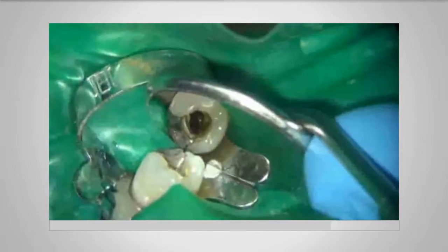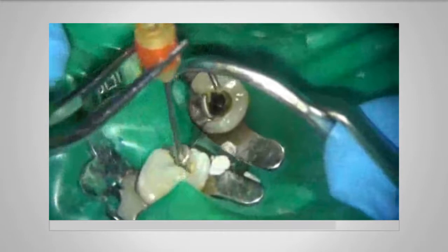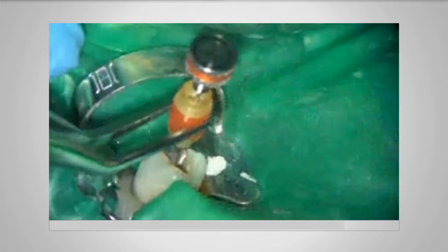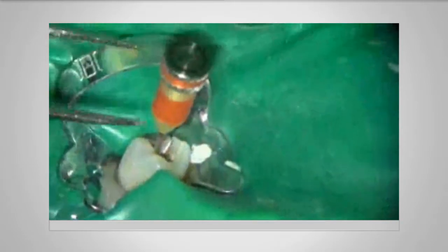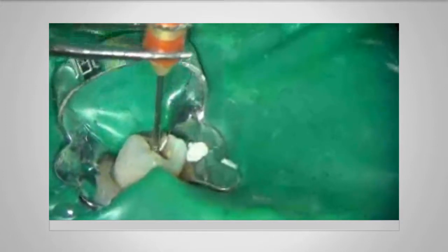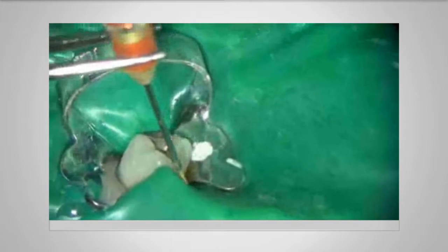This tooth also had a piece of silver point in there, and you can see that through the microscope there. So I'm just inserting the tube back over that, and again rotate the same as before, anti-clockwise to lock it. And then gently retrieve. So the IRS system is very useful for removing pieces of fractured instrument from the mid-third, the amber zone of the root canal.